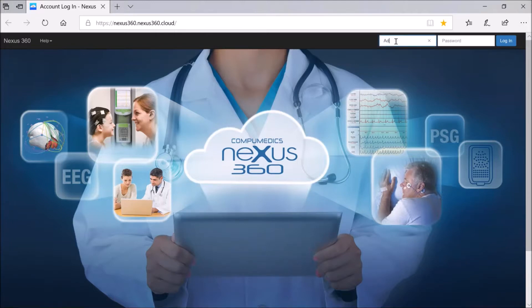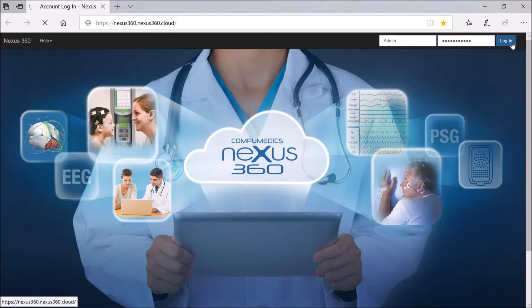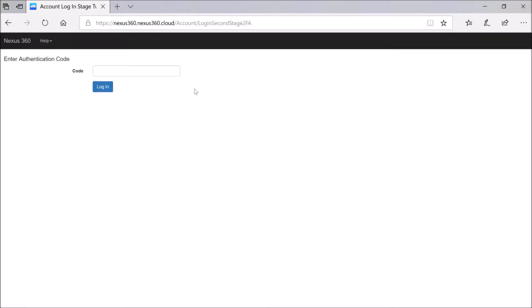Whilst we're waiting for this information to update, we'll log into the web browser — I could be on a remote machine or within the same network. I'll type in my username and password. I'm logging in with administrative privileges, so I have all privileges for the purpose of today's demo. I've also got two-factor authentication enabled on this server, so I have to enter a six-digit code sent to my mobile device as added security.